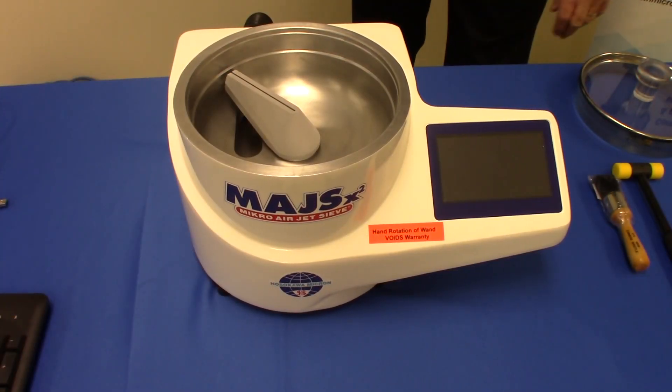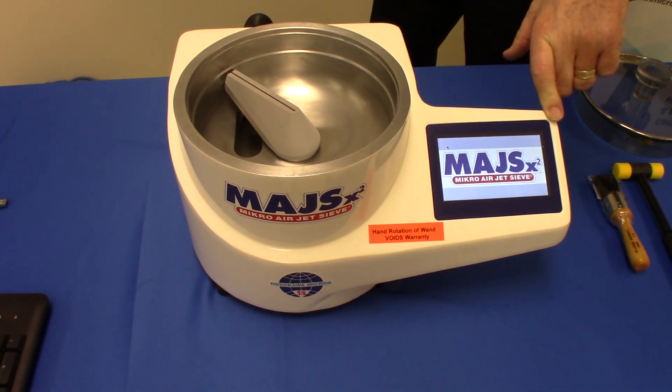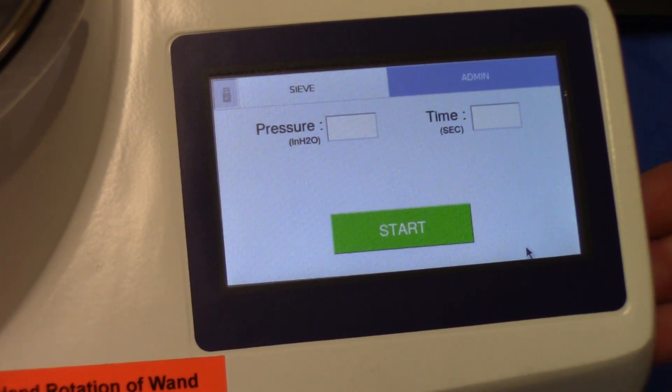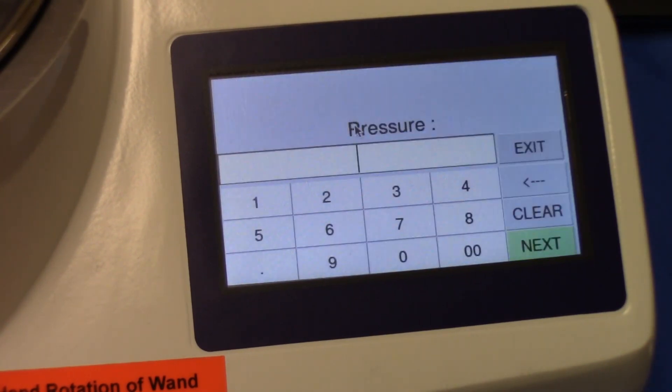We'll power up the software, allow it to go through its diagnostics and setup, and it will display the basic screen arrangement. After the instrument has fully loaded and stabilized, we can add our vacuum pressure. Hosokawa Micron Powder Systems recommends between 8 to 16 inches water column — we'll put in 12 for the moment. Sieving time is dependent upon the product; if the product is extremely friable you may reduce it. We commonly use 120 seconds.